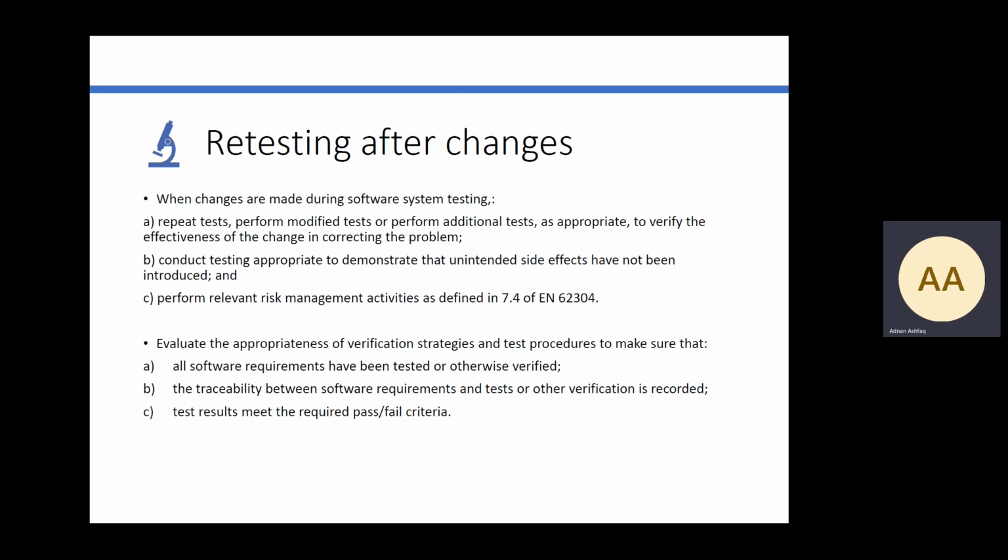Evaluate the appropriateness of verification strategies and test procedures to make sure that all software requirements have been tested or otherwise verified. The traceability between software requirements and tests or other verifications is recorded, and the test results meet the required pass-fail criteria.